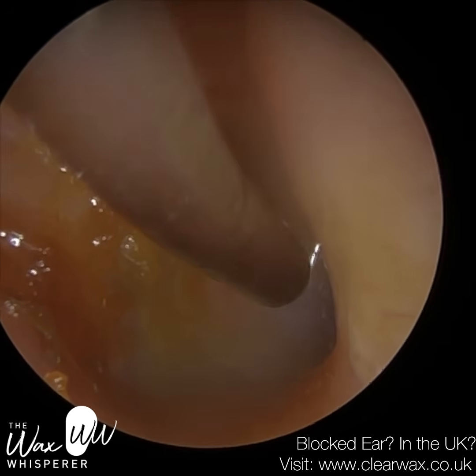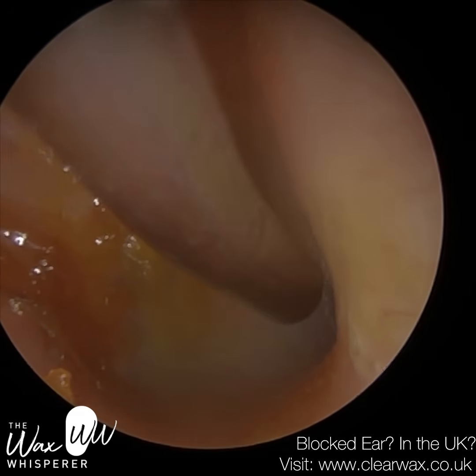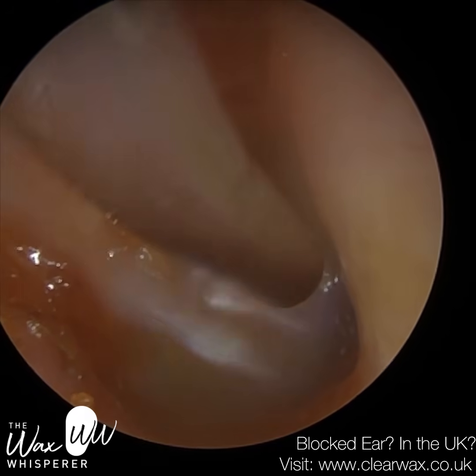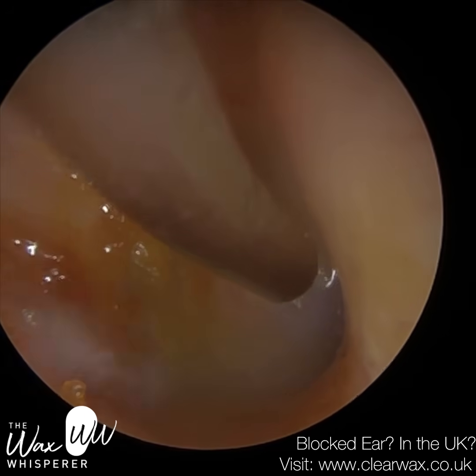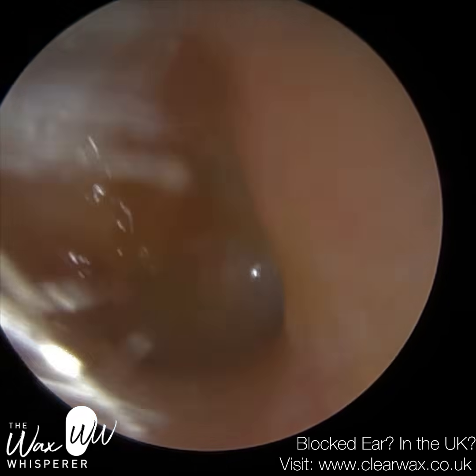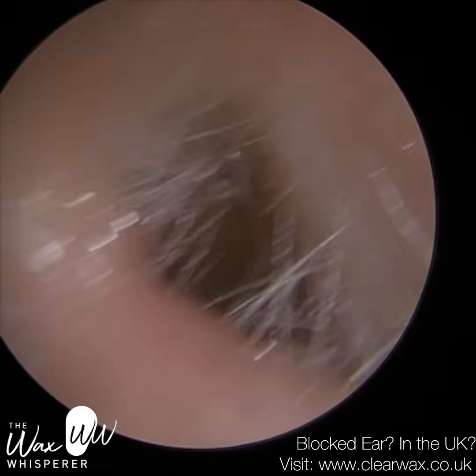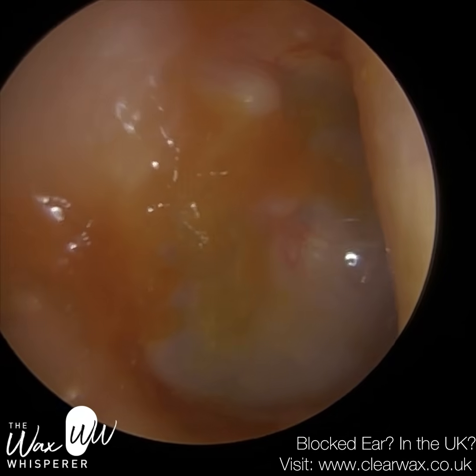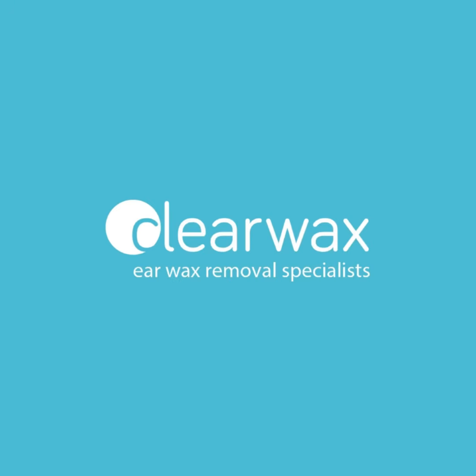So it's just a bit of a puddle of oil. You can see how I've bent the tip of the suction probe, and that's to avoid contact with the front section of the ear canal, the anterior canal wall. That part in particular is very sensitive, and if you catch that and graze that, it can be quite painful for the patient. So I think I'm happy with that. There's a bit of staining around the edge, but as you can see, we've done everything we can to try to remove that. And there's a point where you think, quit while you're ahead, because we don't want to cause any trauma.